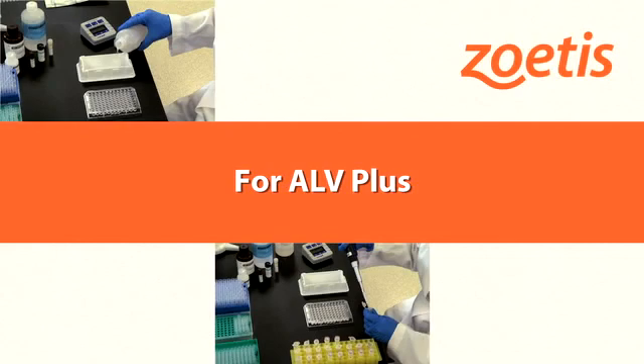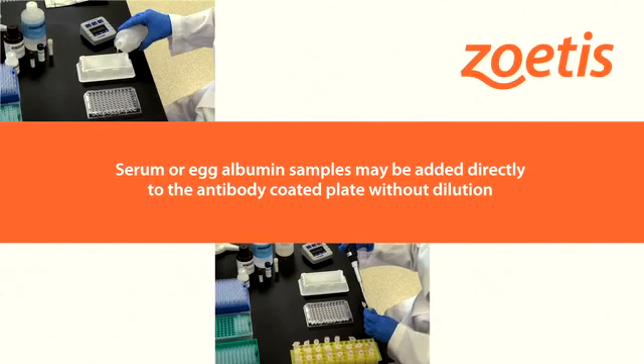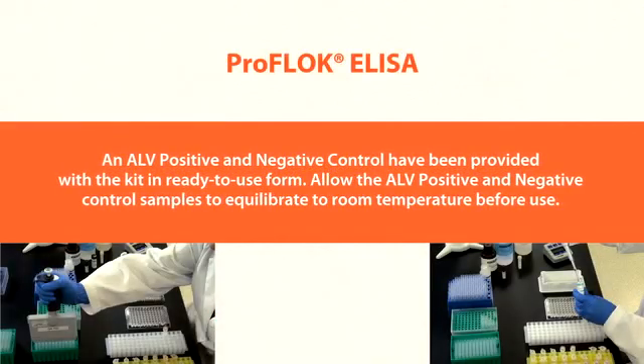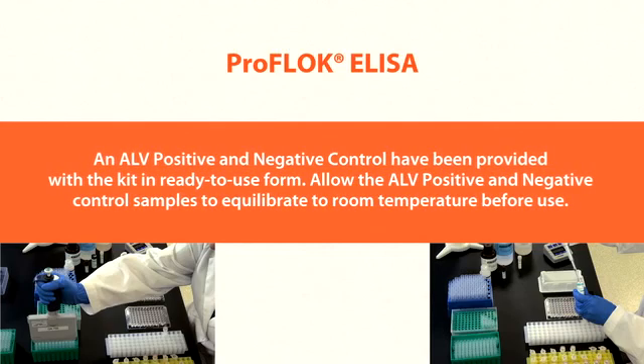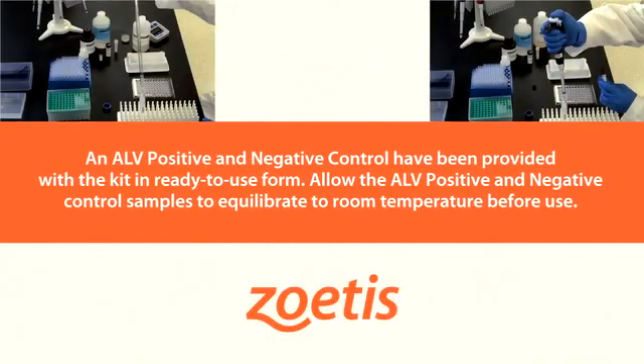Special considerations for ALV Plus: serum or egg albumin samples may be added directly to the antibody-coated plate without dilution. An ALV positive and negative control have been provided with the kit in ready-to-use form. Allow the ALV positive and negative control samples to equilibrate to room temperature before use.